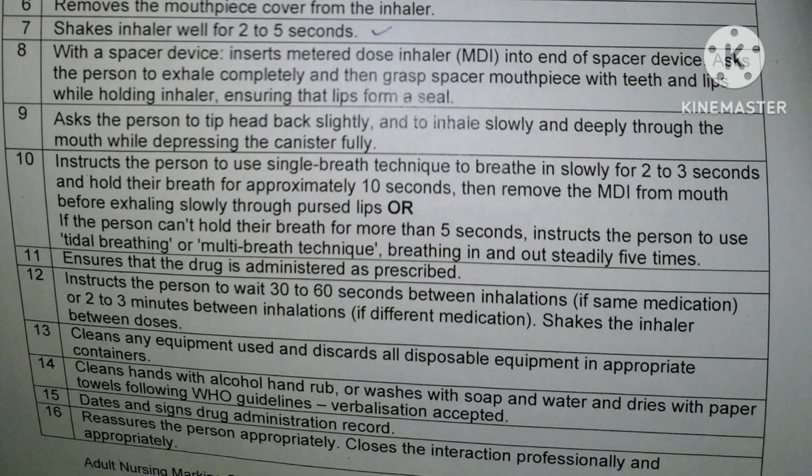What is the next step? Shake the inhaler well for 2 to 5 seconds. Then we will use a spacer device for effective administration of this medication. We should explain to the patient why we are using the spacer device, for the effectiveness of the medication. Insert the metered dose inhaler, that is the Ventolin puffer, into the end of the spacer device and ask the person to exhale completely, then grasp the spacer mouthpiece with the teeth and lips while holding the inhaler, ensuring that the lips form a seal.